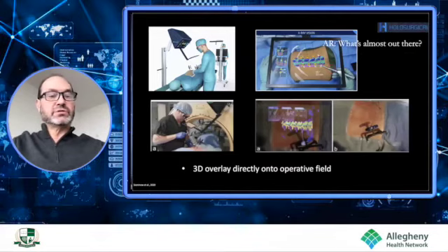Then Holosurgical, which I'm proud to say was developed by Chris Semenoff, one of my ex-fellows at the University of Illinois in Chicago, essentially, as you see in these images, provides some degree of 3D imaging. It involves arrays in the field, a surgical tool, and still requires a distant tracker, which you see in the top image. That creates 2D imaging and then makes a 3D image, which is projected onto that screen that you see sitting overlying the patient. So certainly a step in the right direction, but still doesn't get by a lot of the limitations of some of the navigation issues we've talked about.